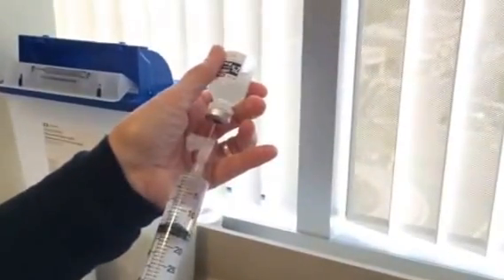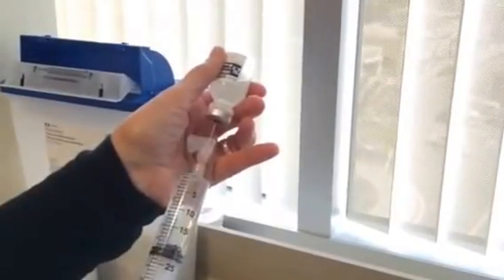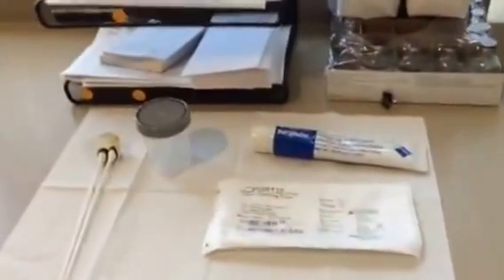The dose in milligrams of lidocaine seems to be the important part. So if you don't have 2% available, you could use 20 cc's of 1% lidocaine — that would also be 200 milligrams. The bladder instillation is now complete and ready to go, and can be taken into the patient's room.